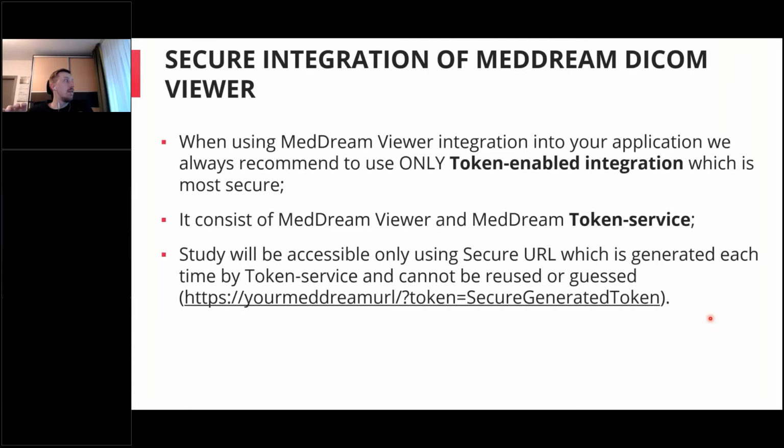Just for now, as I might forget later: if you are an advanced user and you do not want to use, for example, MedDream token service for some reasons, it is possible for you to develop your own token service. You just need to implement the generate and validation endpoints where the token could be generated and validated. So this is also a possibility.